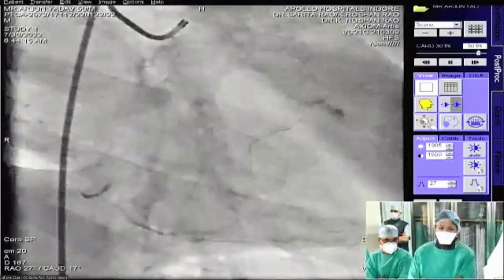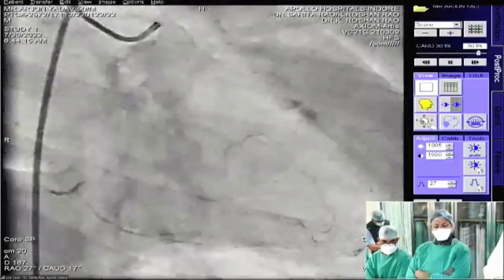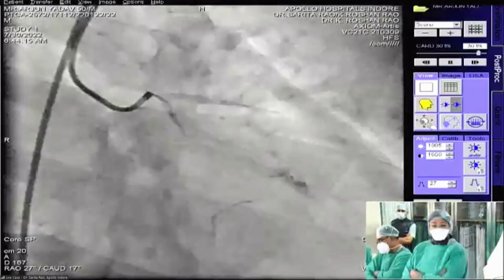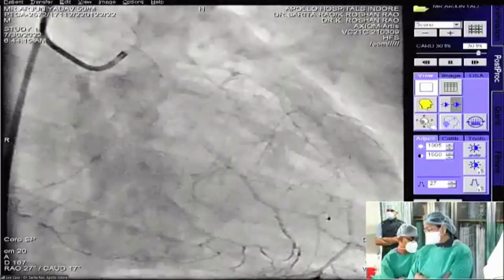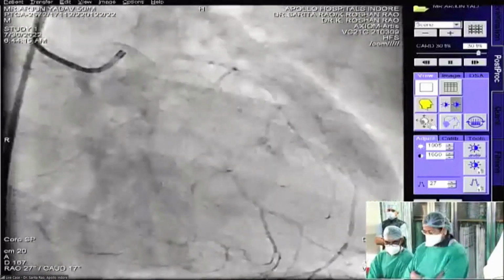Okay. So thank you for all the lovely comments, and we really appreciate it. Now, the ejection fraction looks a little better because right now he's on a 10 mcg dose of adrenaline. Second is whether I'm willing to take the risk. This patient actually has no other choice. He's a surgical reject.